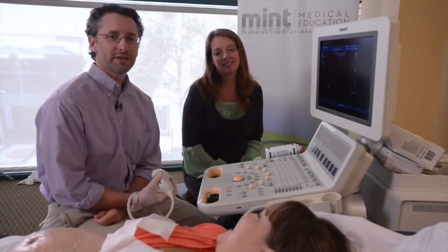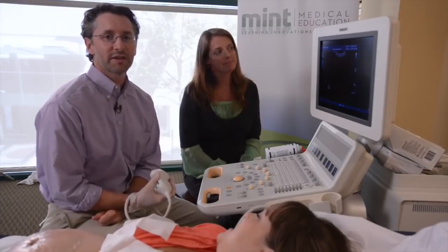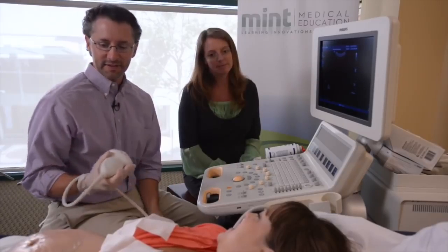And I'm Dr. Tony Philly, and we're here today to talk about the second trimester growth and anatomy scan.